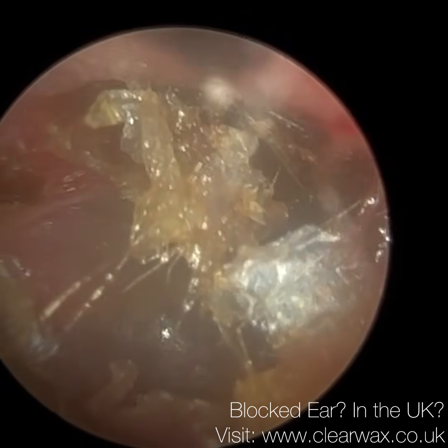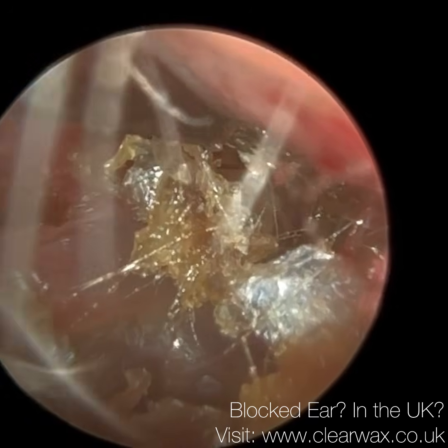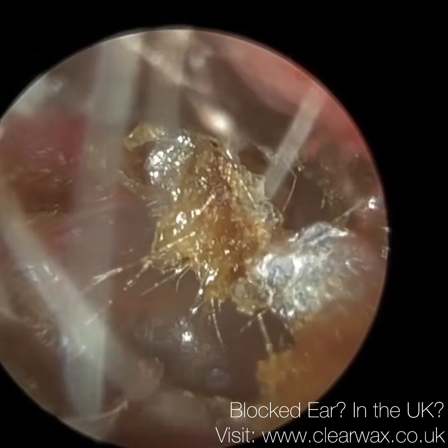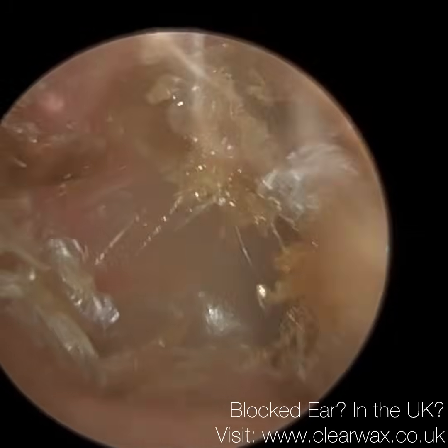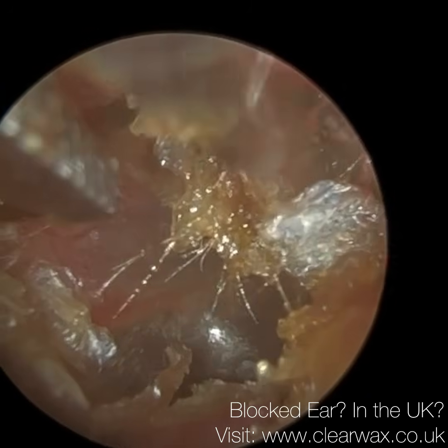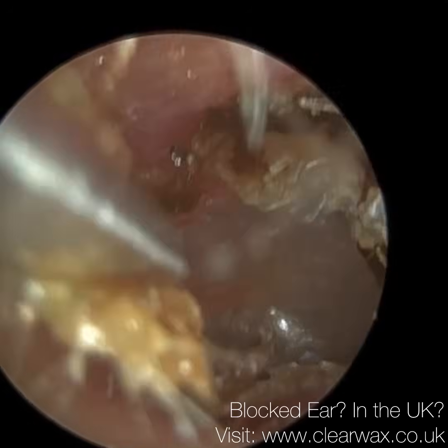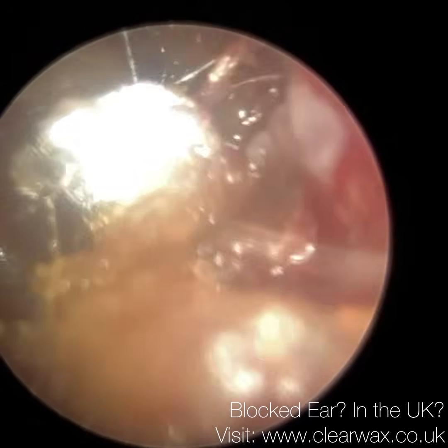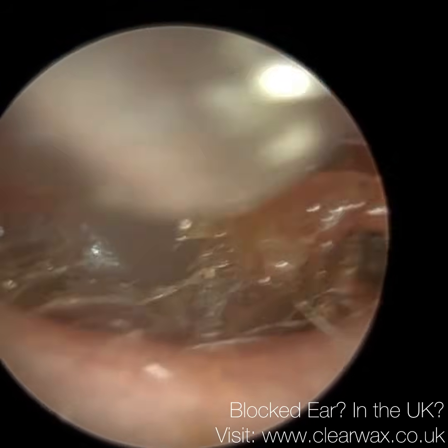So granulation tissue is inflammatory tissue, and it's essentially connective tissue that forms as part of the healing process or inflammation process. And this connective tissue forms its own blood capillaries. So it has its own form of neovascularization. And when you're removing adhered skin and wax here, you're going to rupture these blood vessels that are formed in the granulation tissue. So another term for that, I think it's called contact bleeding.